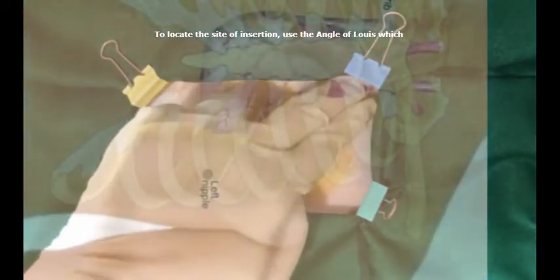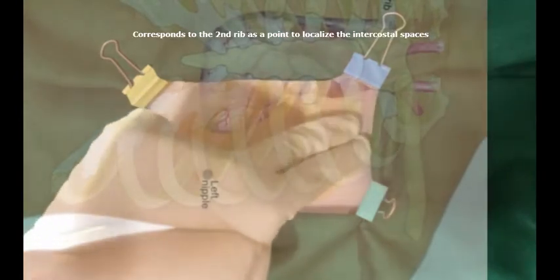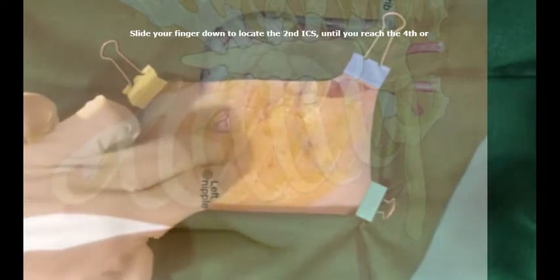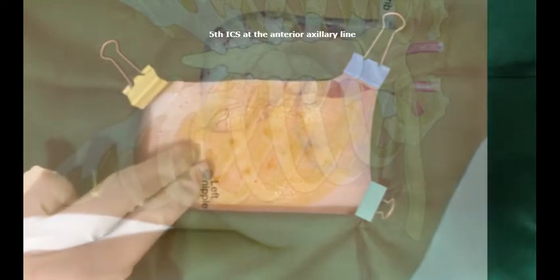To locate the site of insertion, use the angle of Louis, which corresponds to the second rib, as a point to localize the intercostal spaces. Slide your finger down to locate the second intercostal space until you reach the 4th or 5th intercostal space at the anterior axillary line.